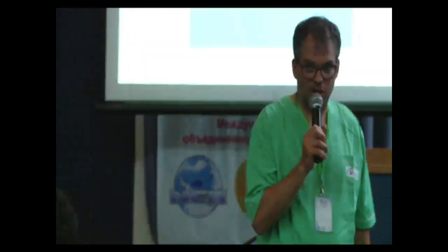So thank you very much for that comment. Actually, this is something that I mention at every web training, and Marcos will go over the data, but the web is not a magic healing device. It does a good job, as we see in studies. I say it does it in 80%. It does a decent job. In 20%, it fails, and this is something you need to be aware of. So if you do 10 cases, you will see 2 where the web doesn't do the job. It's a statistical thing. We see it in every study we run. We run a lot of studies. That's what we see. It's a good result for wide neck bifurcation aneurysms, but it doesn't make you happy if you see it. I understand that totally.